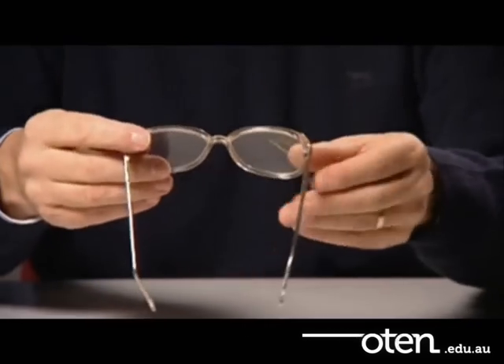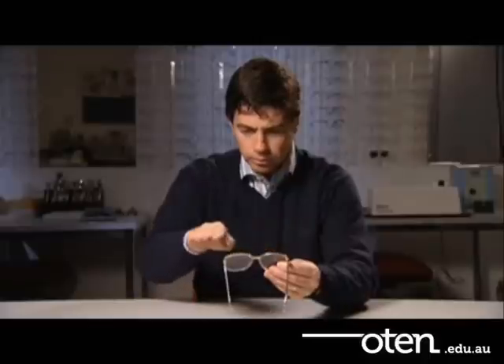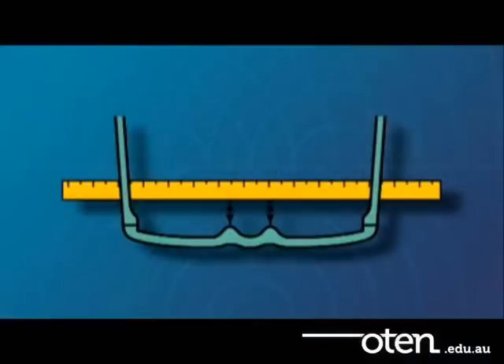Check that the horizontal alignment and bow of the frame front are level and at the same angle. Here you can see that the contour of the frame front has a gentle and consistent bow.